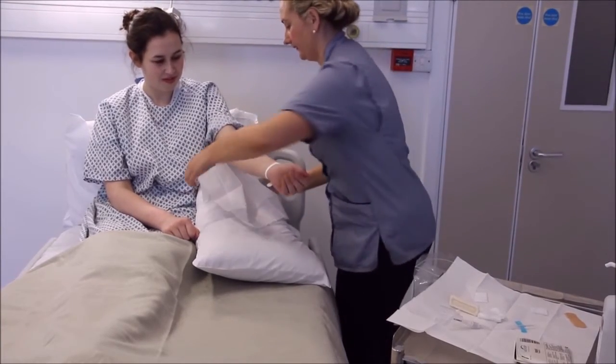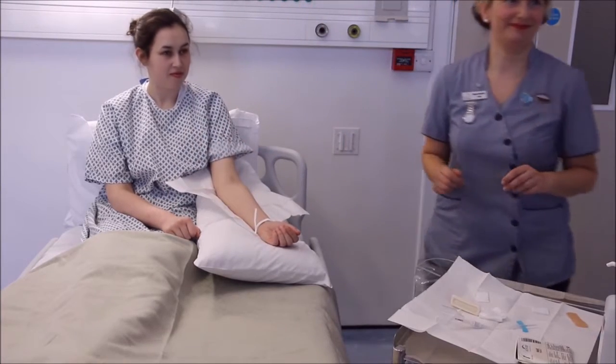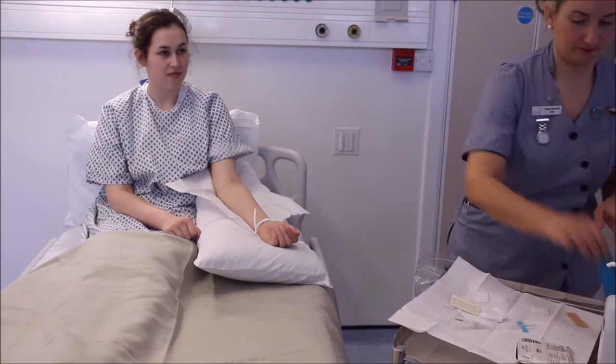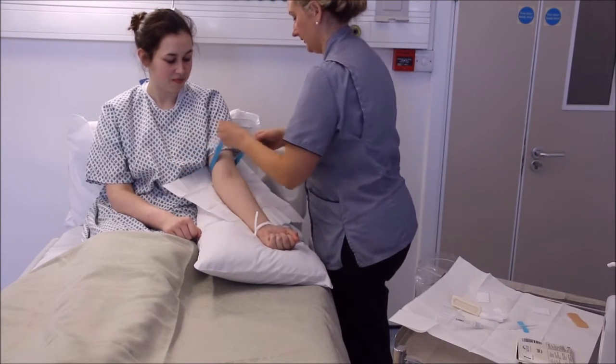Put the sterile drape under the patient's arm. Apply the tourniquet and palpate the vein.